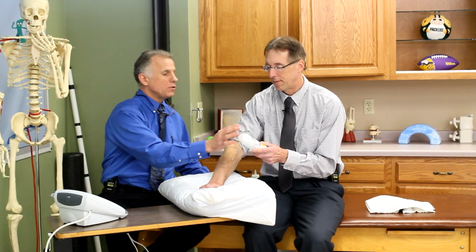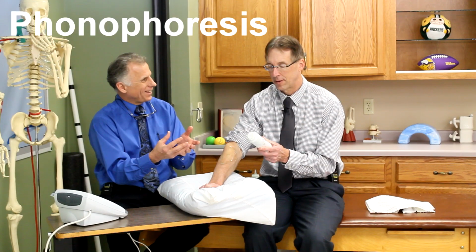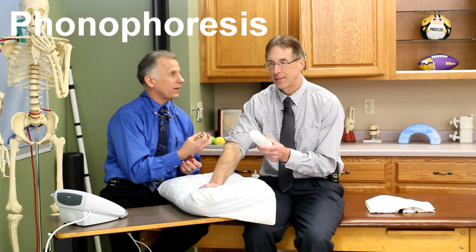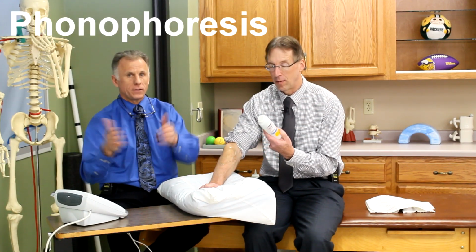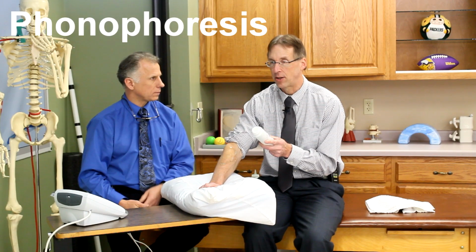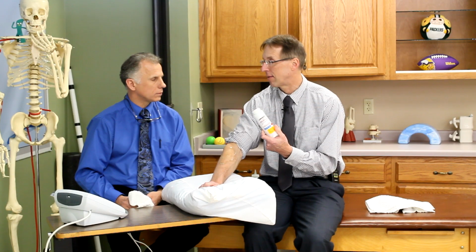When you use ketoprofen, it's no longer called ultrasound. It's called phonophoresis. The medication is going to be pushed through the skin into the affected area, and that's the phoresis part of that term. We've had good luck with this. To be honest, Brad, I always tell patients that usually if it's going to help, you're going to see some relief within 2 to 3 treatments. First one, not usually, but usually 2 or 3. We have a lot of people that get some relief from this. It's kind of a go-to for us.